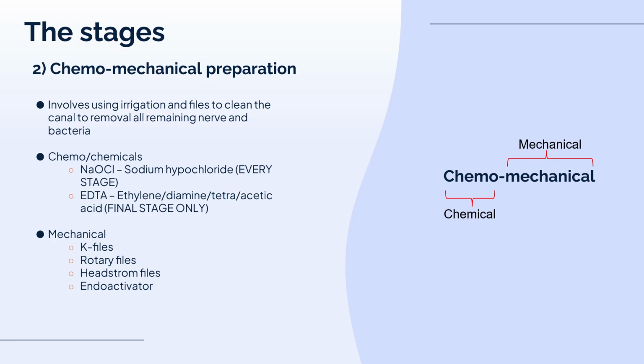EDTA, a bit of a mouthful, ethylenediaminetetraacetic acid. I use this only in the final stage. Okay, some dentists may use this every stage. I use it only in the last stage. Okay, again, this is how I do root canal. A lot of dentists do it this way, but obviously when you come to work with the dentist that you're working with, you have to learn their preferences.